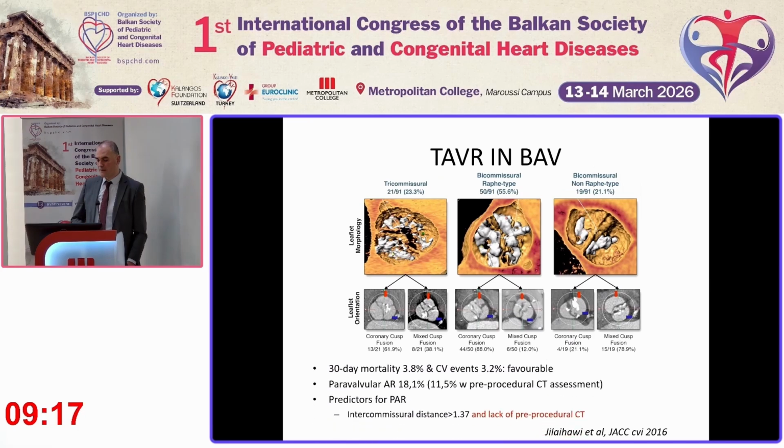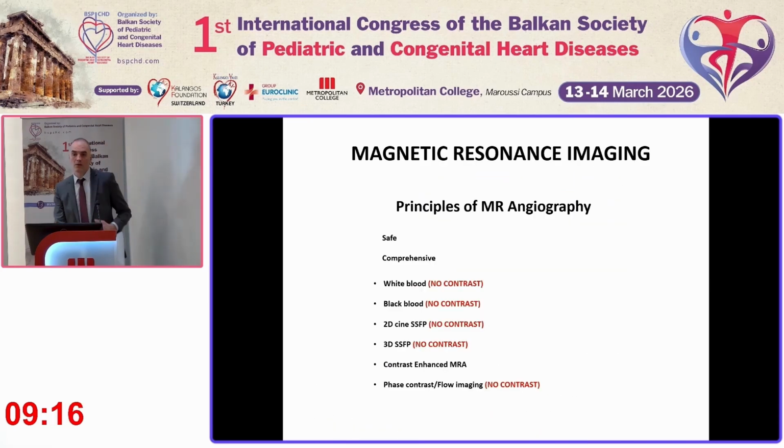Fine. Next. So, cardiac MR. Cardiac MR is a key exam in congenital heart disease in general, and in particular in bicuspid aortic valve assessment as well. It has specific advantages that are unique. It's safe, it's comprehensive. There is no use of radiation.